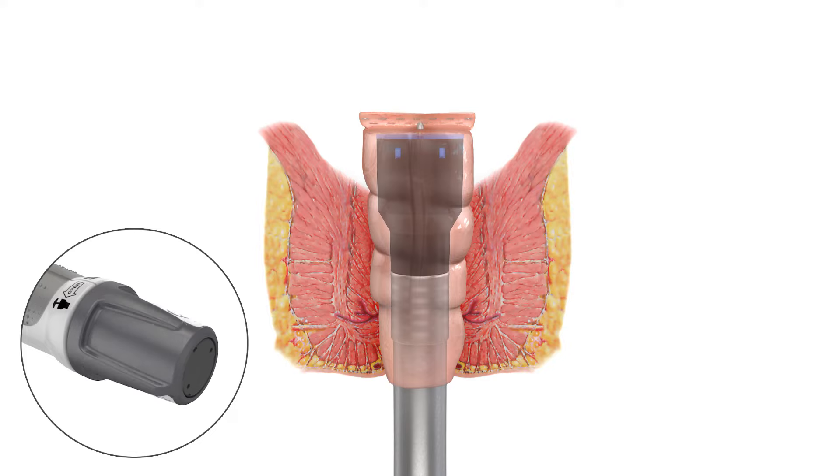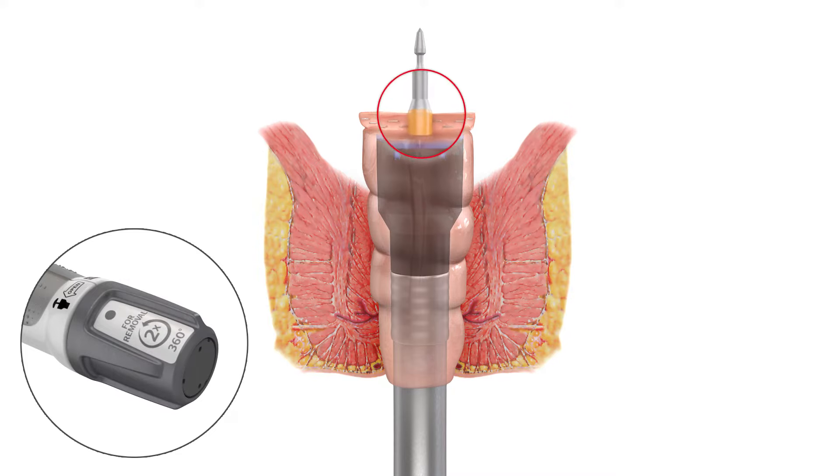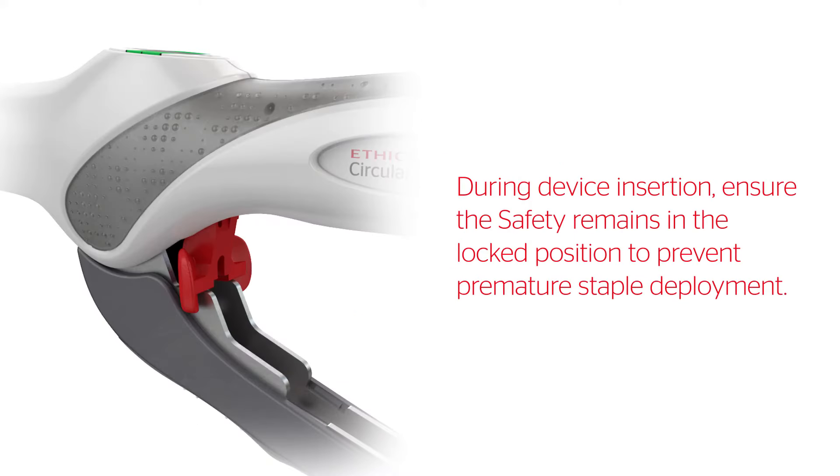Fully extend the device trocar and pierce the distal transection site with the trocar by rotating the adjusting knob counterclockwise. Continue to extend the trocar until the orange band is visible. During device insertion, ensure the safety remains in the locked position to prevent premature staple deployment.